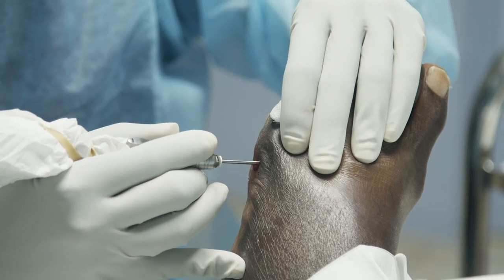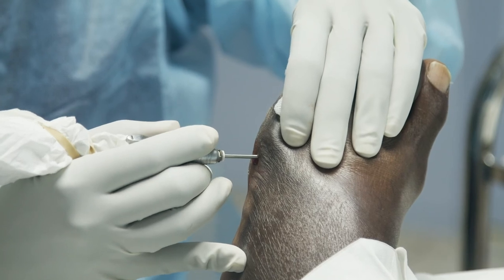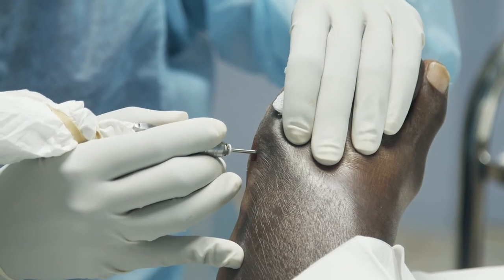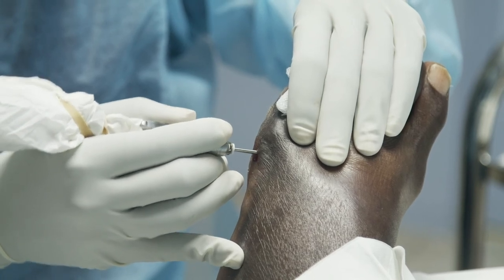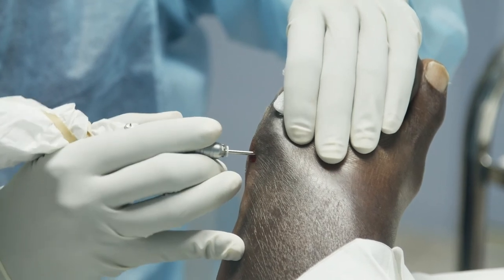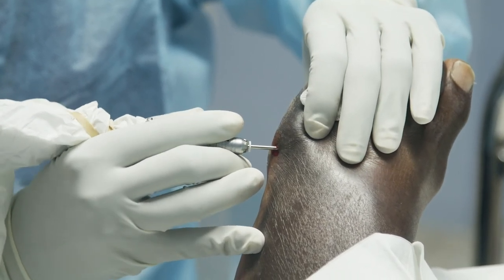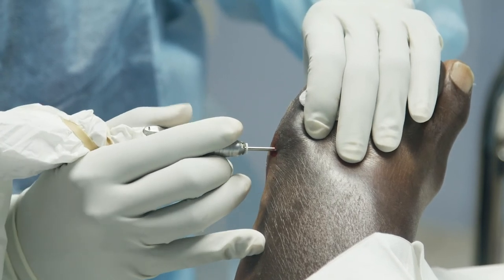And here we go. We're in the joint. I'm going right across that base. You see that stuff looks very strange from one cortex to the other. It's no rush. This creates a very fine-tuned cut. It's a low torque, very high precision tool. And I'm feeling on both sides of it, so I know when I'm getting to the other side. Then I'll come out and make my precise cut.